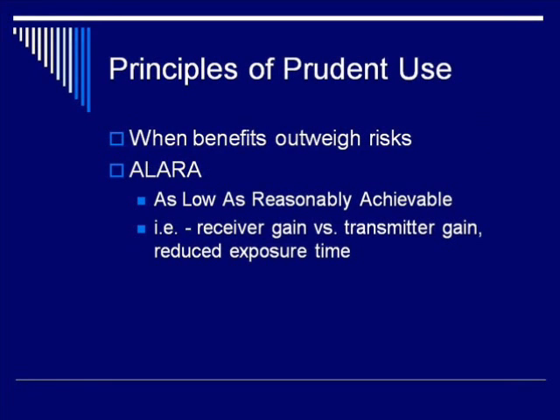As with any study, we use ultrasound when the benefits outweigh the risks. And although I've just gone through the risks in quite a lot of detail here, the risks of ultrasound are still quite low. To keep ourselves in line when using ultrasound, we use something called ALARA, as low as reasonably achievable. You want to use the lowest power and keep the risk as low as you can and still achieve your goal, which is to obtain good ultrasound images.